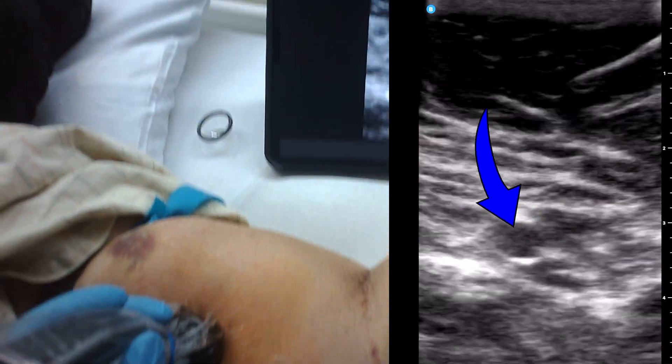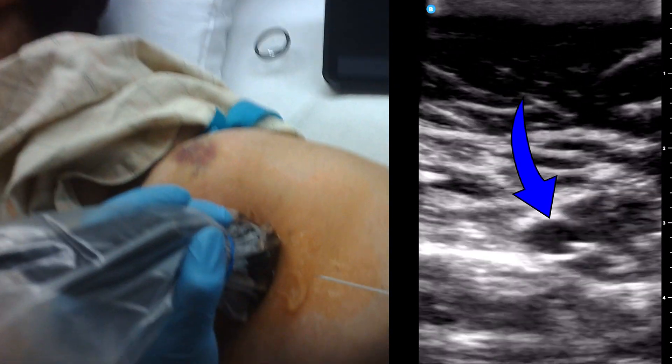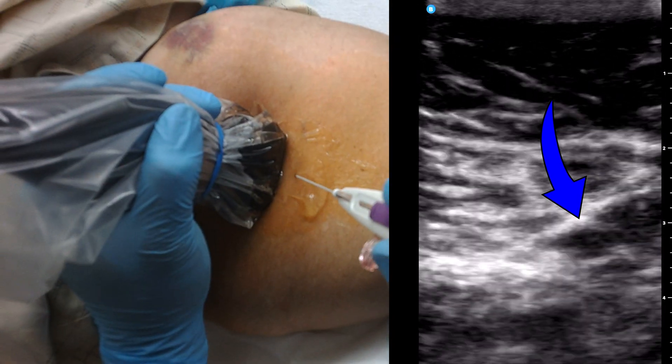I like deeper veins because it helps me to see better — I have more wiggle room to adjust. For this prick, the skin is the most sensitive part, so I'm going to go pretty fast so she doesn't feel so much of it. Three, two, one — stick.